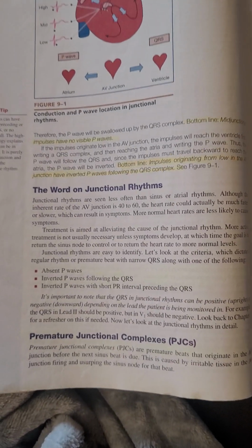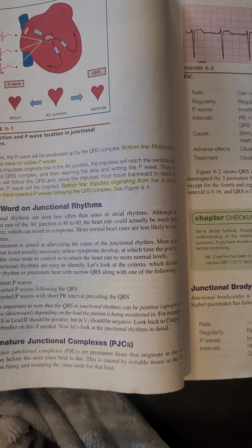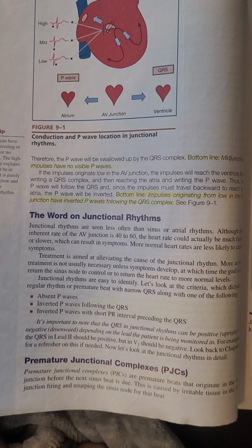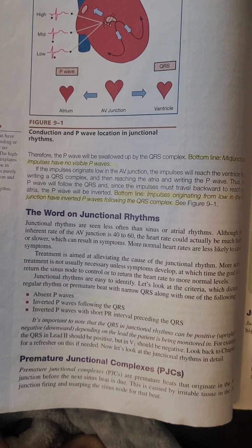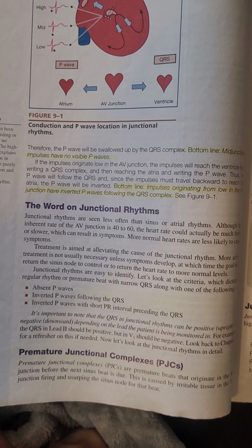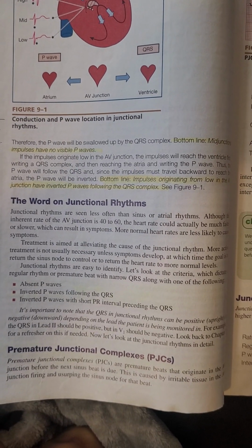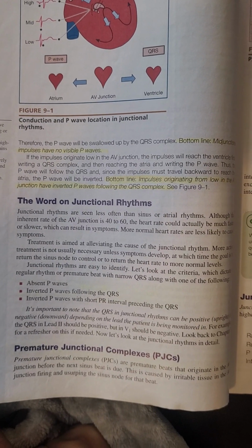It says junctional rhythms are seen less often than sinus or atrial rhythms. I never really saw too many of those junctional rhythms, but you will see them. Although the inherent rate of the AV junction is 40 to 60 beats per minute, remember we said as you go further down the heart, the heart is not so healthy anymore. So the sinus node is a healthy one, you get the regular 60 to 100 beats per minute. Now at the junction, the heart's starting to beat slower.